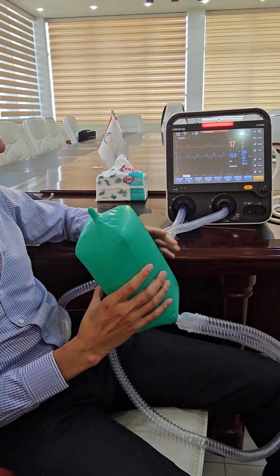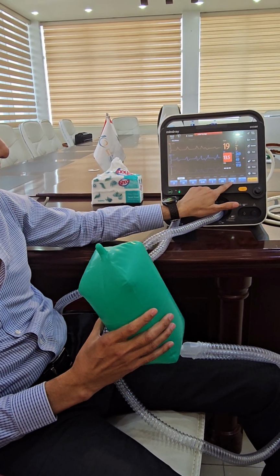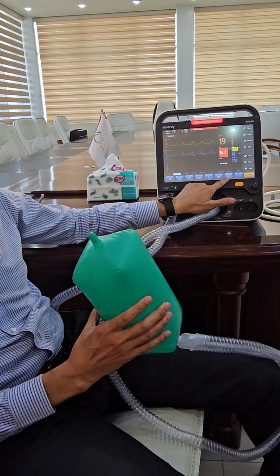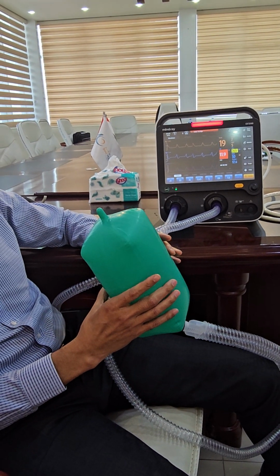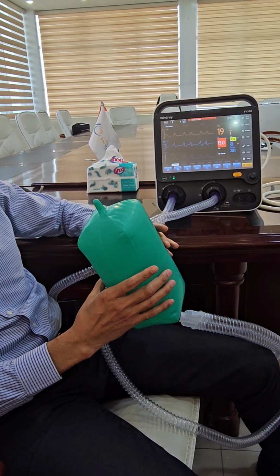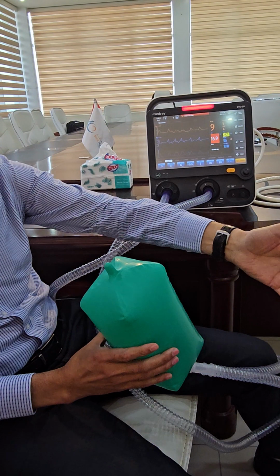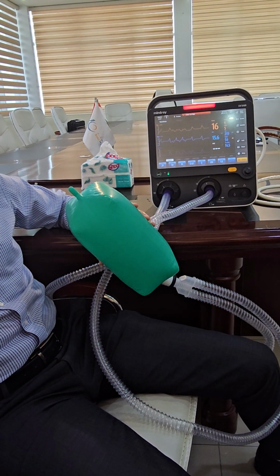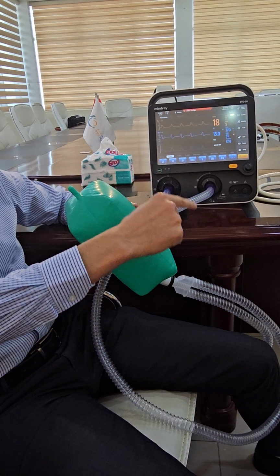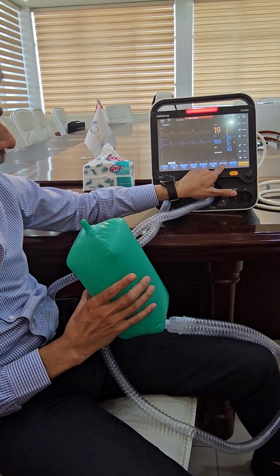Why? Because I determine the trigger. What is the trigger here? You see the trigger is 1 liter, and then it will trigger. This effort is mild, so it's not giving. Once it's a good effort, it will trigger. We'll talk about the trigger later on. Trigger means that to give an assisted breath, the patient needs to pass the preset value.